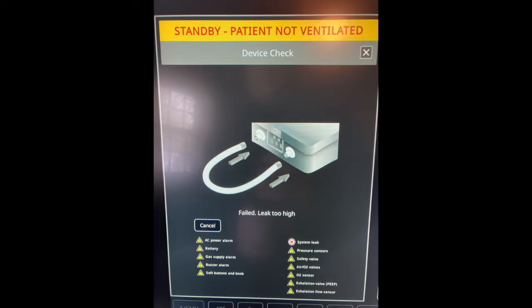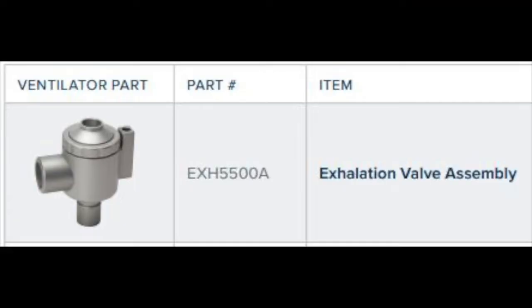From my experience, a high percentage of the leakage has been from the expiratory side. So I have an extra exhalation valve assembly that I just use for troubleshooting to easily pop in and pop out to verify the leaks on my expiratory side.